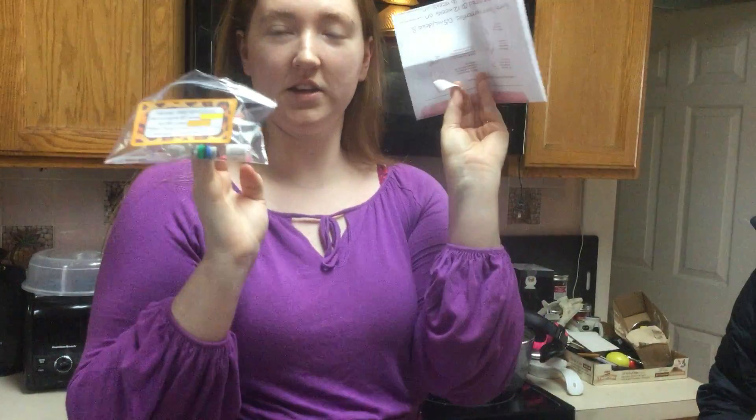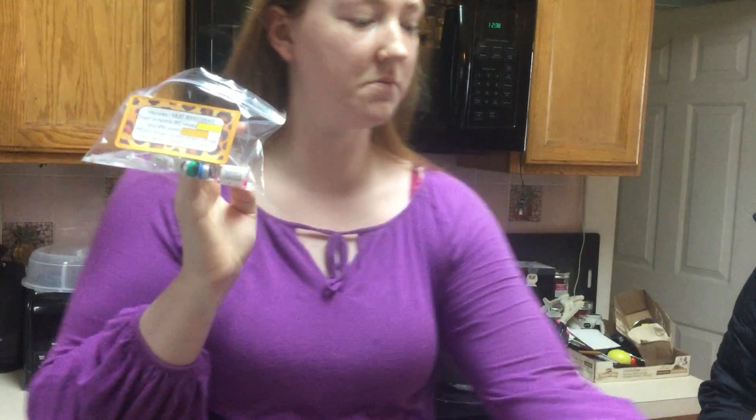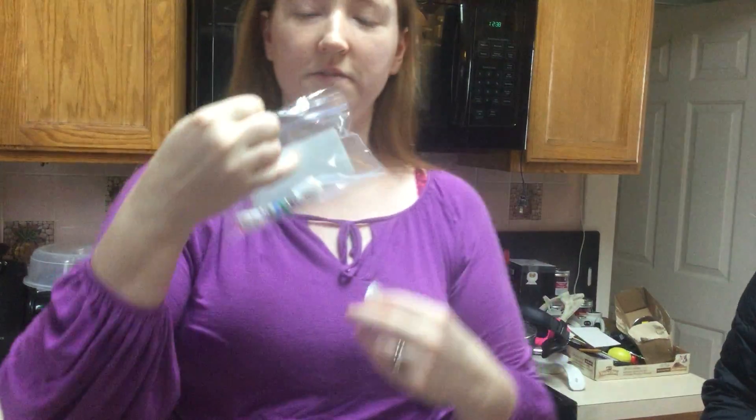Okay, this is educational series number four: how to administer your vaccine. You're going to get a baggie with instructions inside as well, so please look at the baggie instructions. You're going to get four vials for two vaccines.